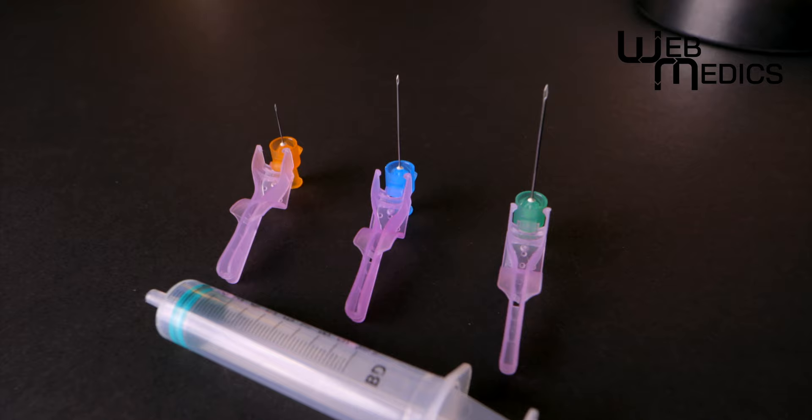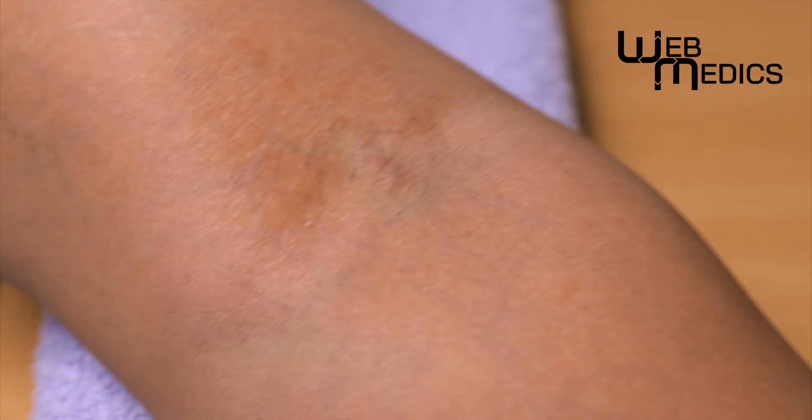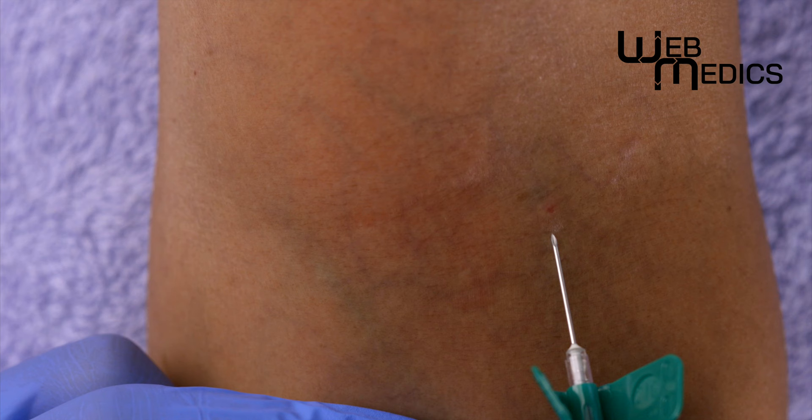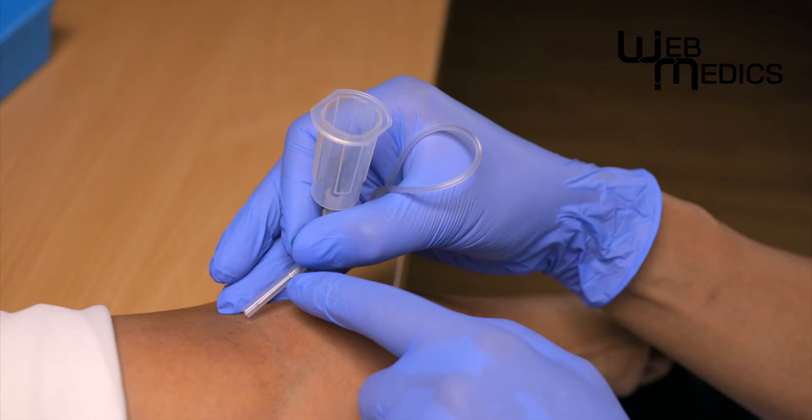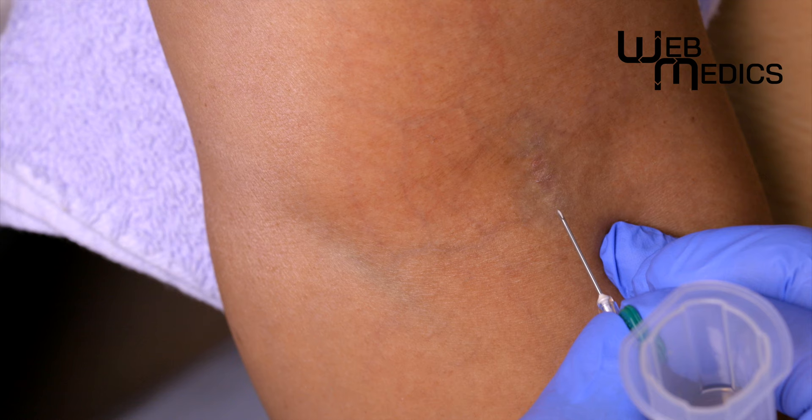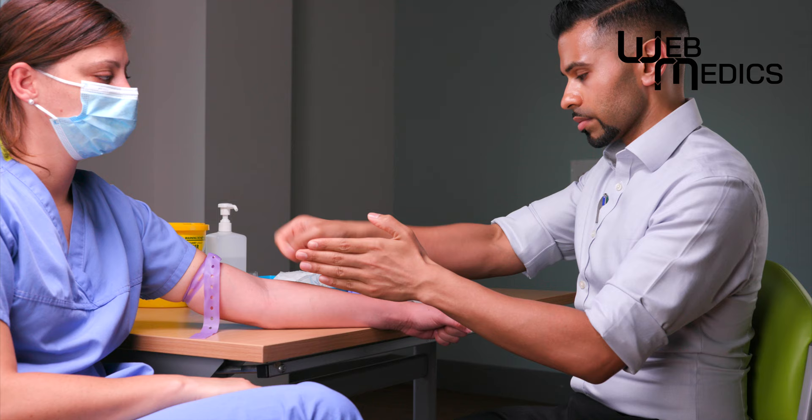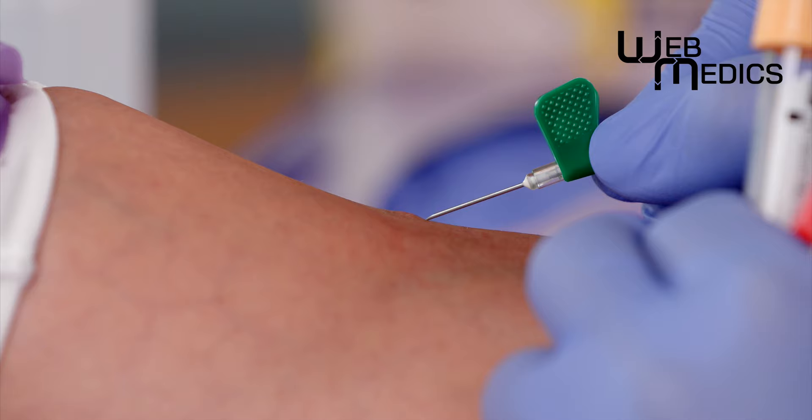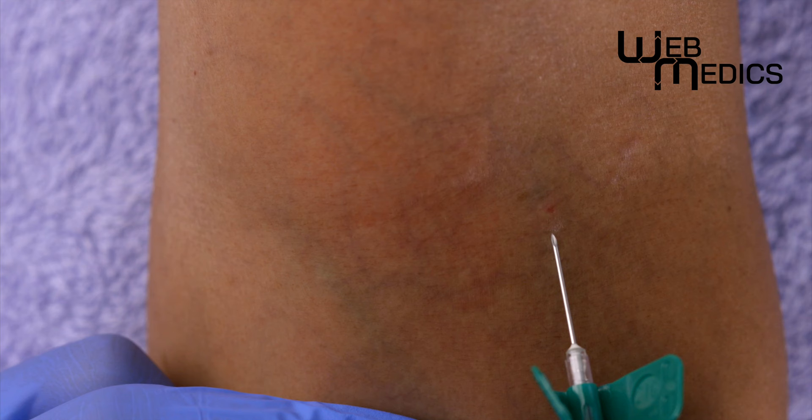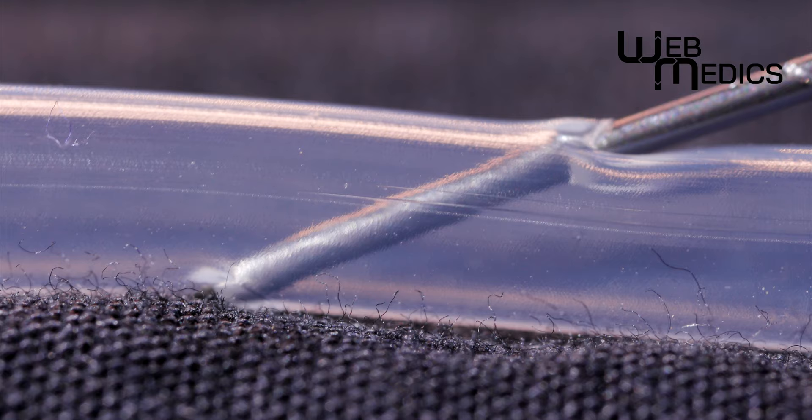Now, do you think it's equally important to draw blood with less pain? How can we make a blood draw hurt less? Here, we position the arm on a table to minimize the risk of the patient pulling back too far due to pain. Here, I align my body to use my natural needle line of 45 degrees counterclockwise to the sagittal plane and I ensure it's aligned with the vein. You might like to watch our dedicated position video for more information. Because this vein is small and non-palpable, I know it's soft and possibly fragile. Therefore, I select a lower, shallower angle, between 15 and 20 degrees. Because I am using a shallower angle, I try to insert just a little quicker to try to minimize pain. A steeper angle with higher insertion speed is more likely to do this.